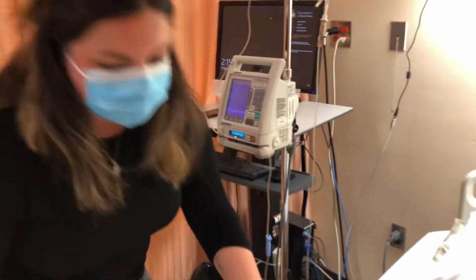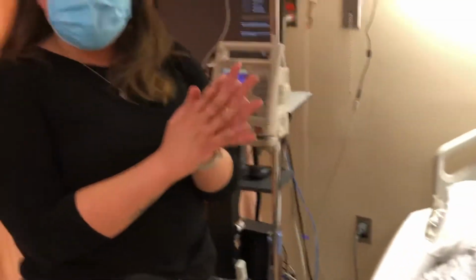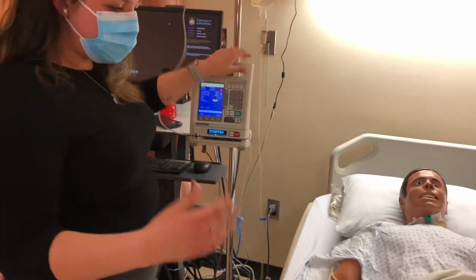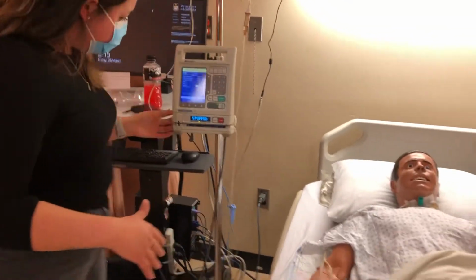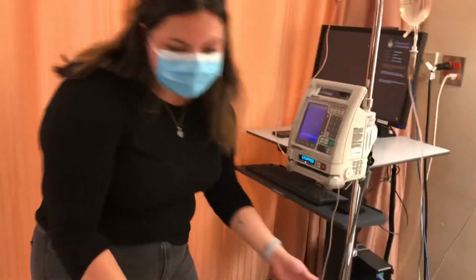So before I start this, I will be assessing my patient's blood glucose and the vital signs, and I will ensure that I can get the blood glucose within an appropriate range as ordered by the physician. So I will be doing those, and I will be monitoring my patient for hypoglycemia as well throughout this. So we are good. I don't have any clamps on. These clamps are good. Everything is running smoothly.